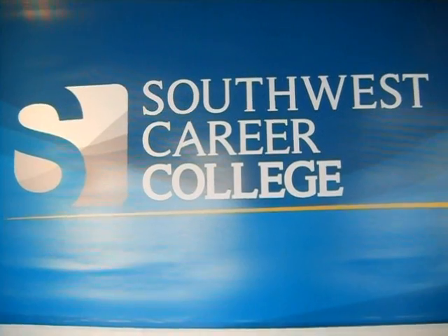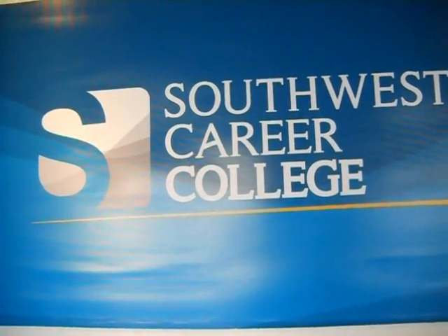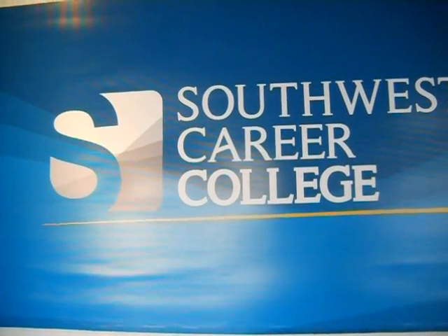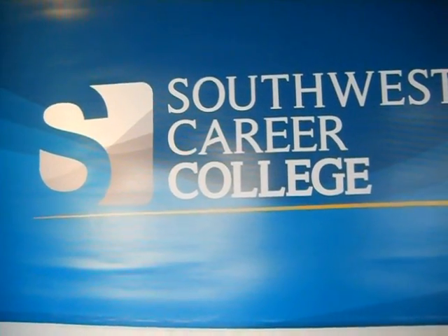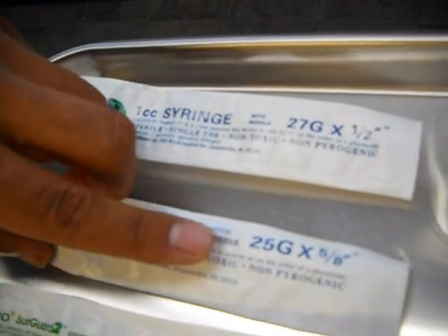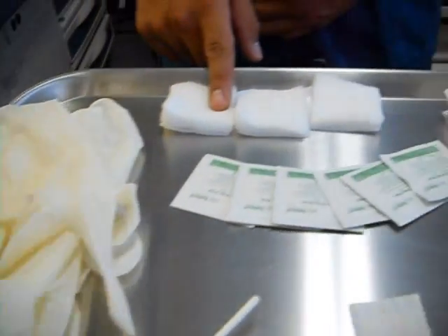Welcome to Southwest Career College clinical procedures. We'll be demonstrating various injections, demonstrated by our male students. I'm Mizra Parra, a student here at Southwest Career College. Today we'll be doing injections. There are three different kinds of needles: the one inch for intramuscular, the five-eighths for subcutaneous, and the half inch for intradermal. You also need certain materials like non-sterile gloves, non-sterile gauze, alcohol pads, and band-aids.